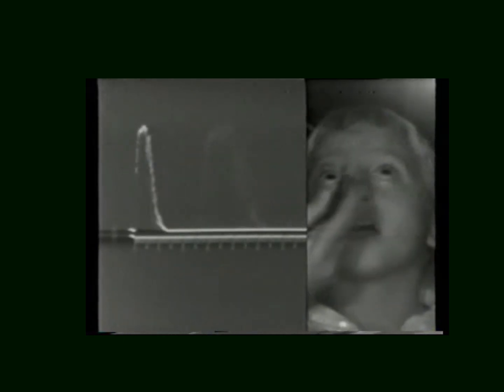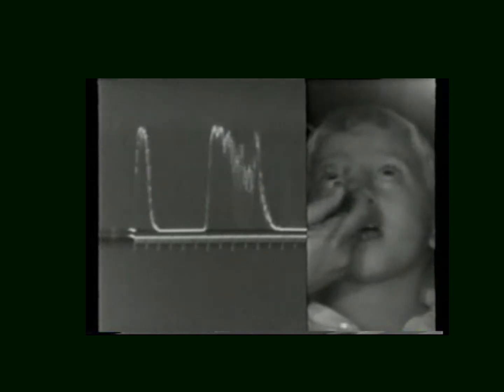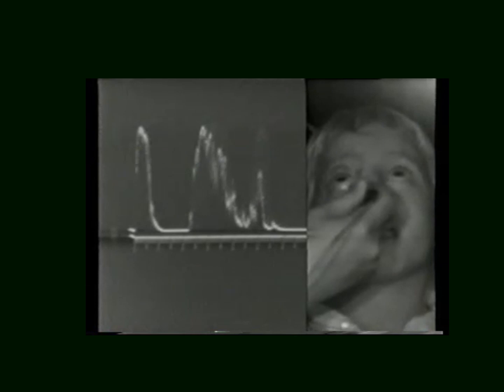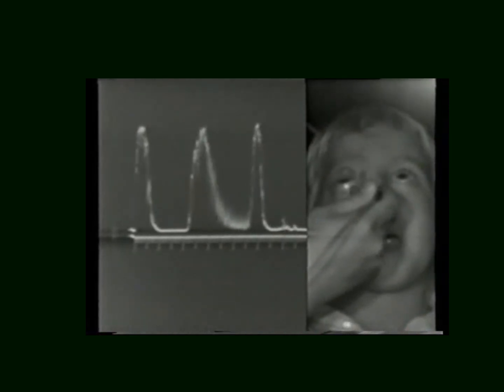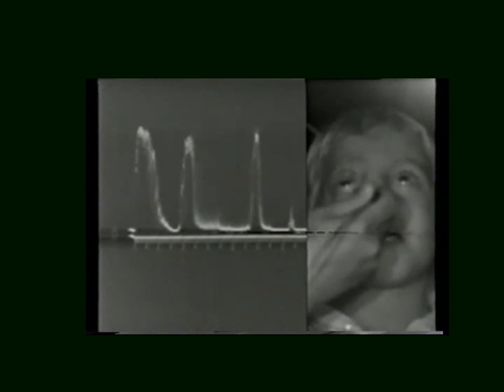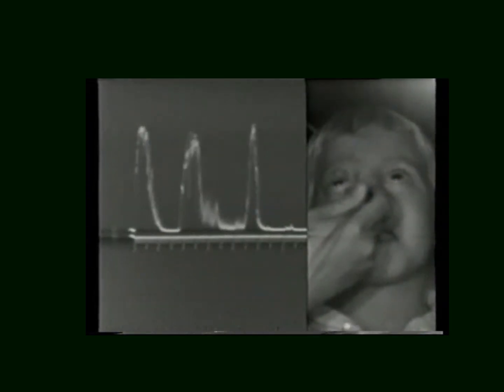This young man had been referred to us with a questionable hemangioma in the right orbit. The left one is normal orbital tissue. When we place the probe here, we see immediately a large area with fast spontaneous motion. That's not a hemangioma, that is an AV fistula.